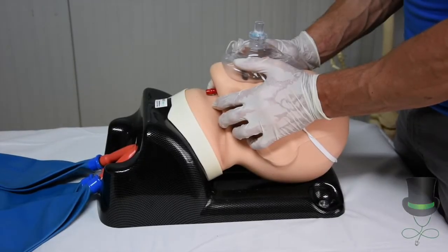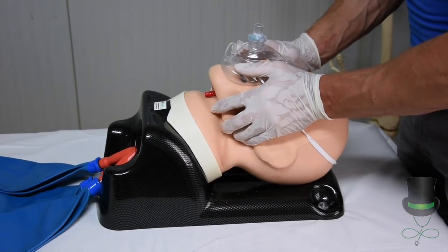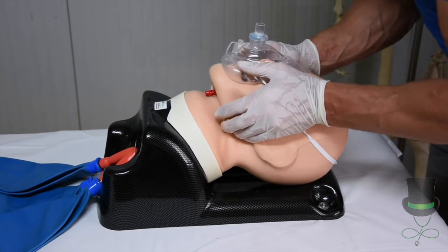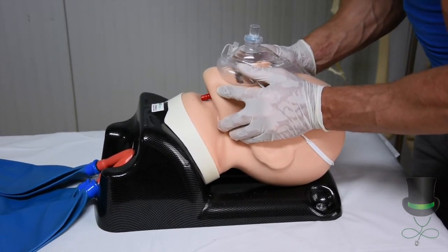When you have a patient with suspected spinal trauma, you will have to use a trauma jaw thrust. You do your trauma jaw thrust with the grip underneath the corner of the jaw, raise up and push out on the chin.